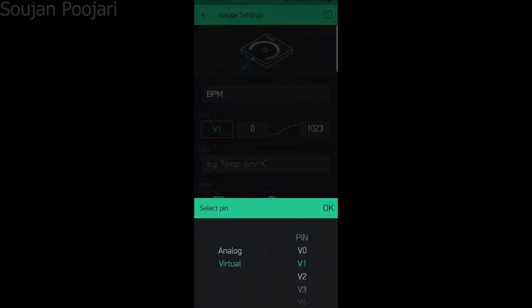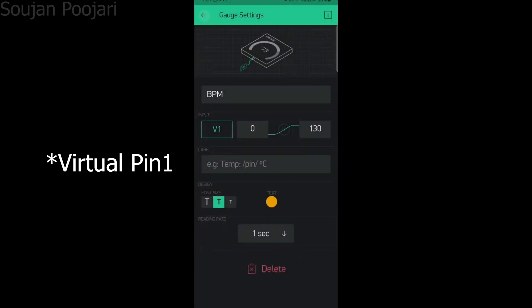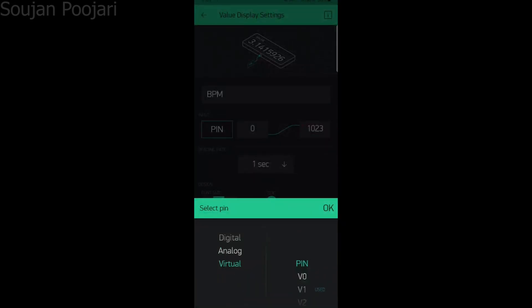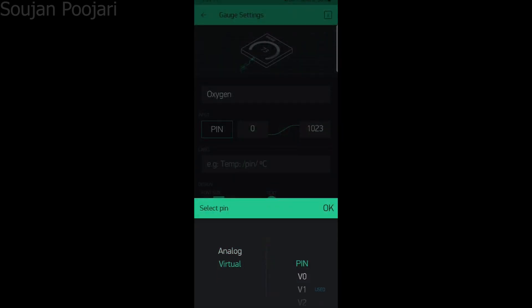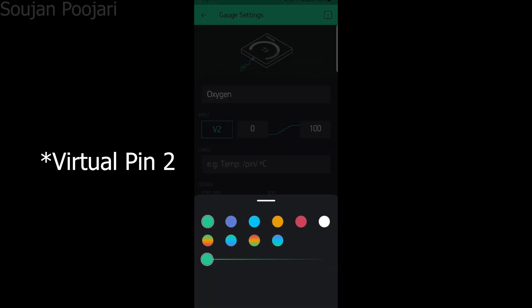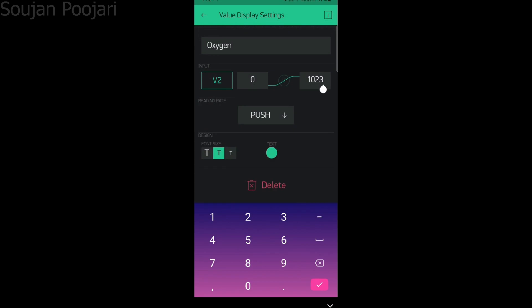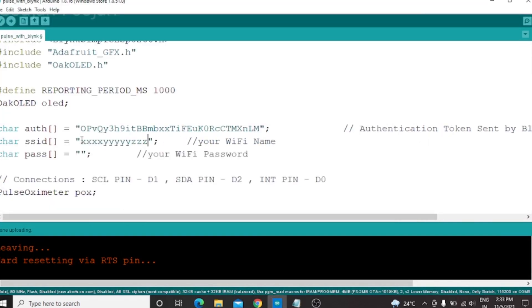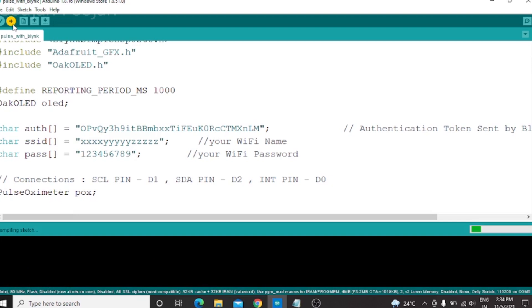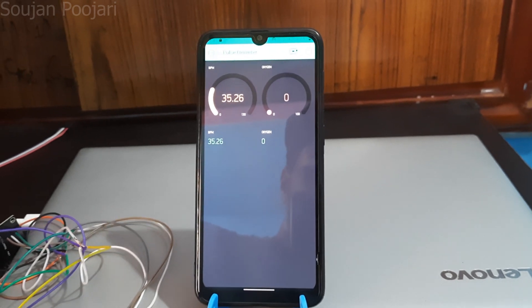Same procedure for BPM in the value display — set the virtual pin to V7 and the number from 0 to 130. Name one more gauge as oxygen, select V8 pin, set values from 0 to 100, and set the delay to 1 second. Same procedure for the value display. Now open the code — enter your Wi-Fi name, password, and the token code received in the mail from Blynk. And finally, the project is ready.